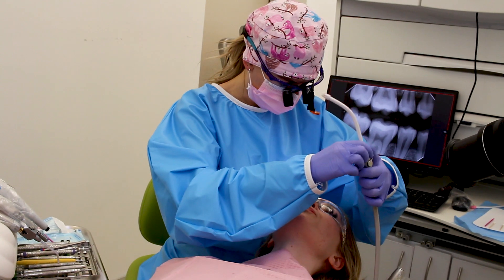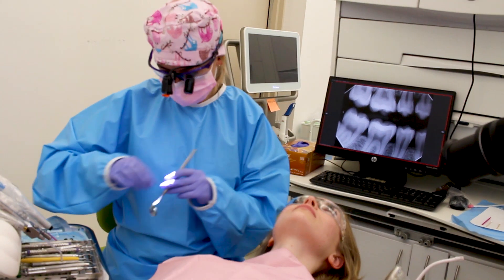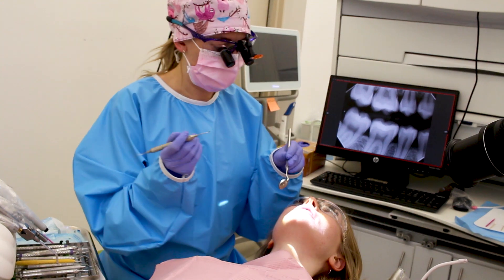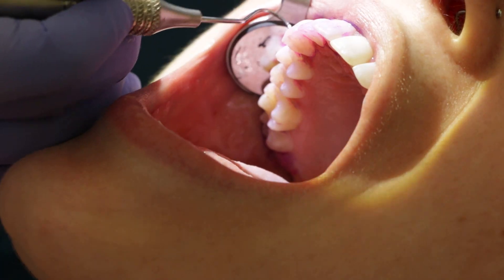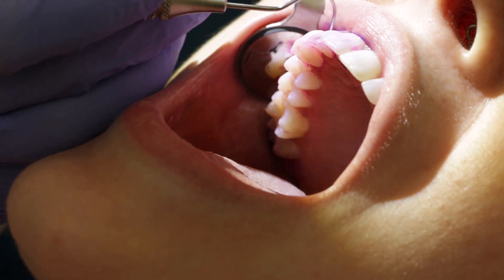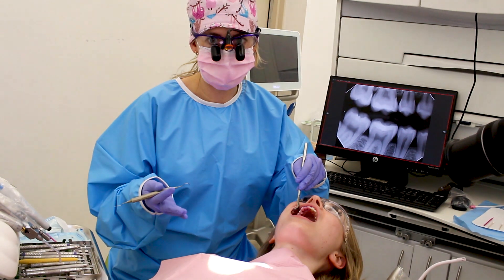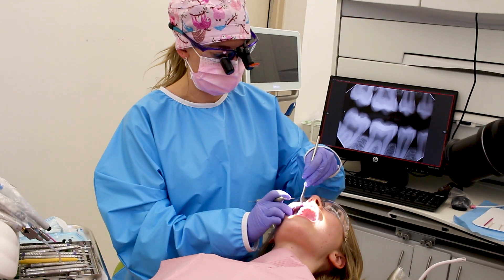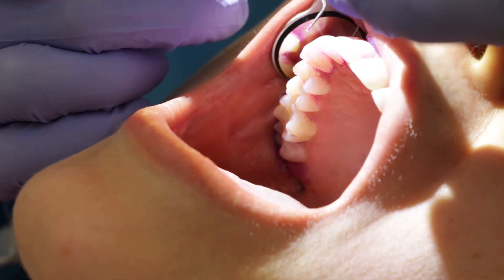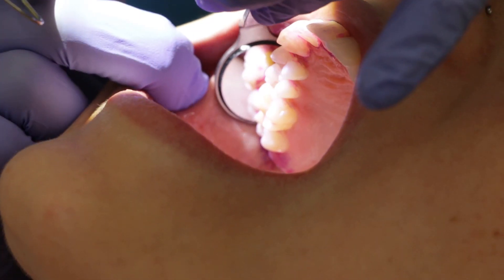Any of the places where you have the deep pink color is where it's actually stained — that's where you have plaque. You can see here on her she still has some plaque in between some of these teeth that needs to be removed. That's what we're going to focus on when we're teaching you how to brush or floss properly — these are the areas you really need to focus on, right in between the teeth.